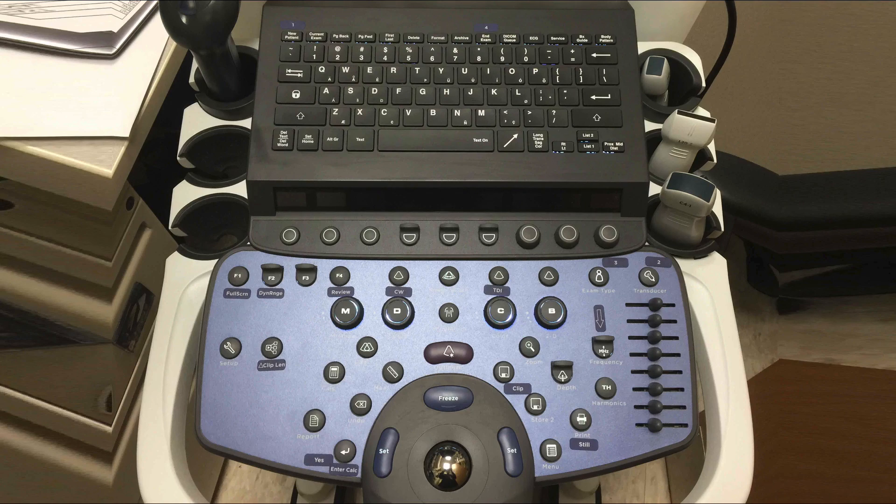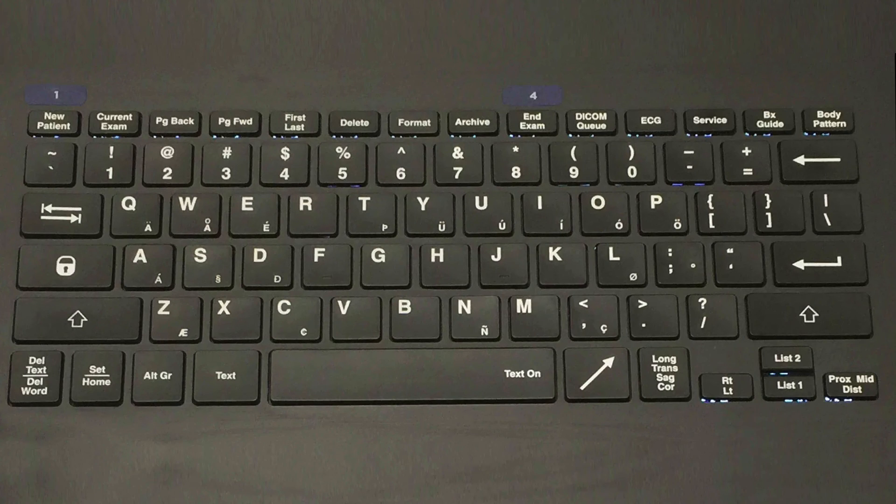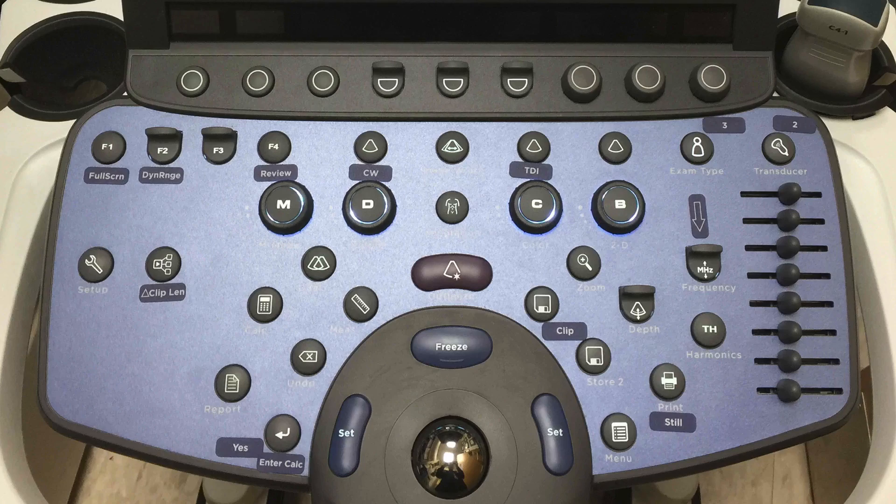Most notably, the new patient and end exam keys, along with the system operation buttons highlighted for frequent use. Remember, ultrasound is dynamic imaging. Don't be afraid to attempt to optimize your image.